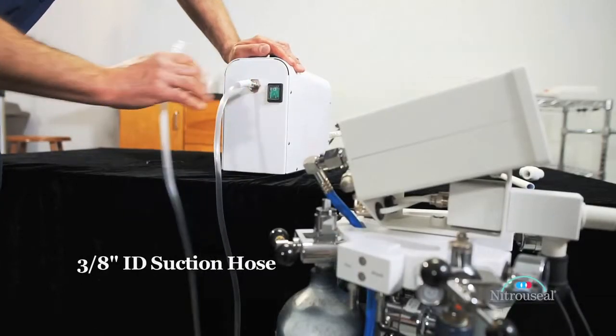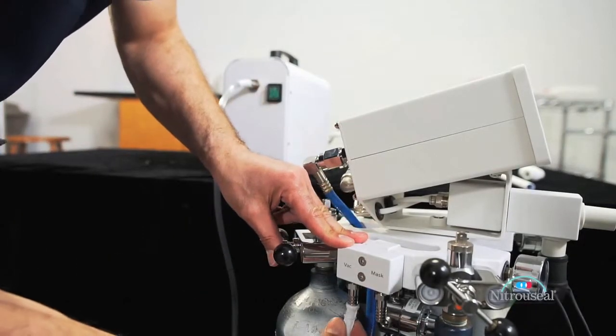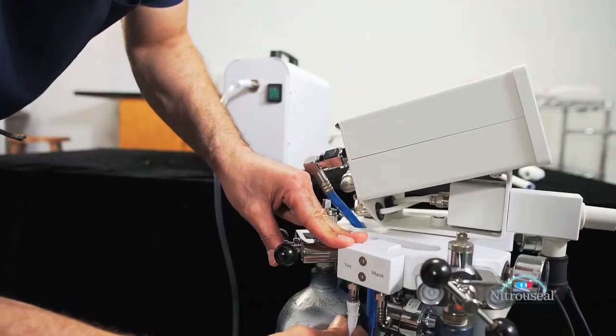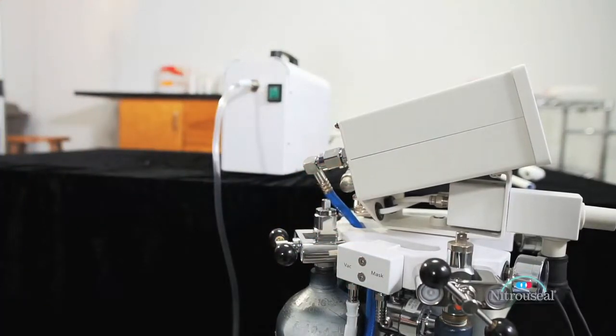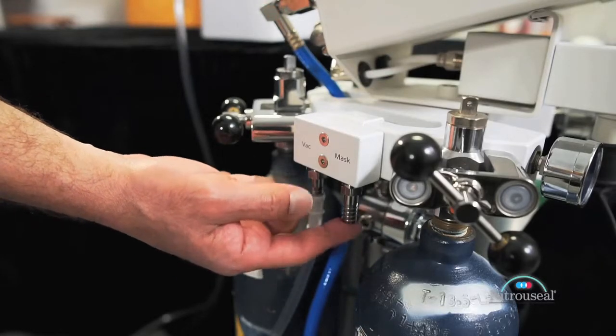Using a standard 3/8 inch ID suction hose, connect the suction nozzle on the front panel of the Mini Scav to the nipple marked VAC located on the remote vacuum block mounted on the flow meter stand. Now test the suction on the nipple marked MASK.